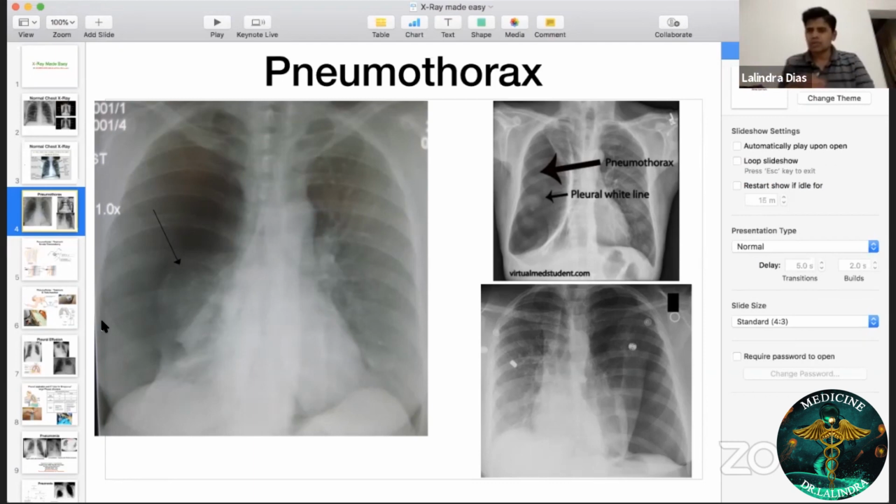And when you drain out air through this IC tube, the patient is like this, the tube is coming out. So if this side is pneumothorax, the tube is coming out, and that water seal bottle should be kept below the patient's level. And you should never ever clamp an IC tube. It's a take-home message. Please remember this golden advice for your whole life. You must always tell the nurses, never clamp IC tube.